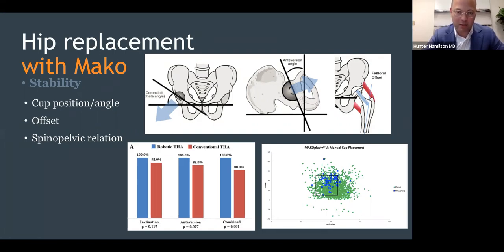However, this can be problematic in the OR as the pelvis rotates or moves while we're performing surgery. And sometimes the cup can go into a position that you don't really appreciate that it's in. Also, with deformity and degenerative changes over time, or maybe congenital abnormalities, the bony landmarks inside the pelvis are not quite as identifiable and can make this challenging. And so using robot-assisted surgery with that antenna on the hip and having the ability to three-dimensionally restore your normal hip center of rotation, we're able to carry this out much more successfully.